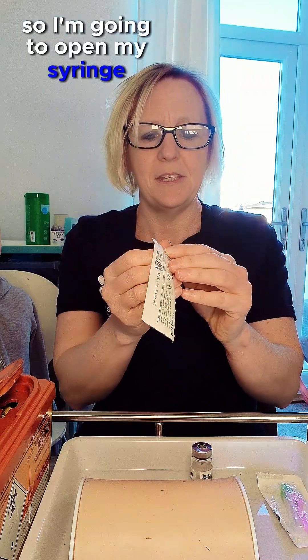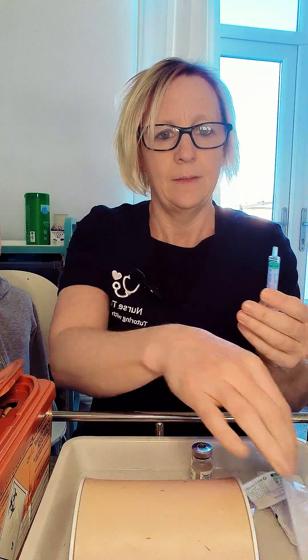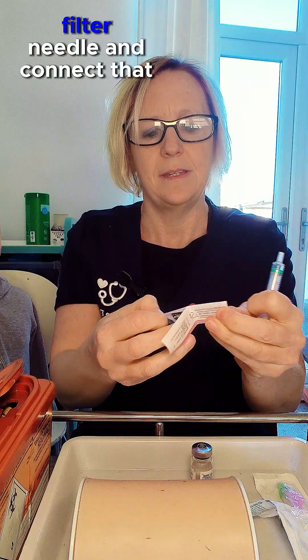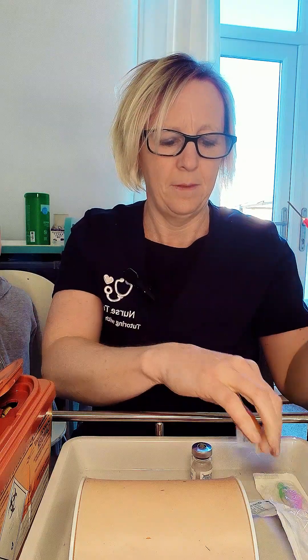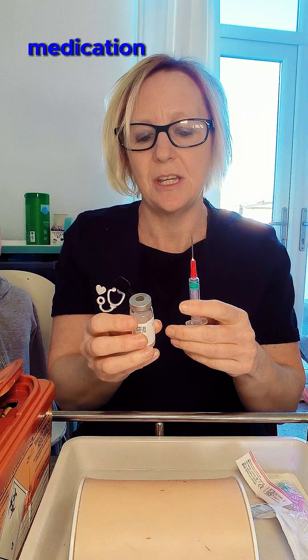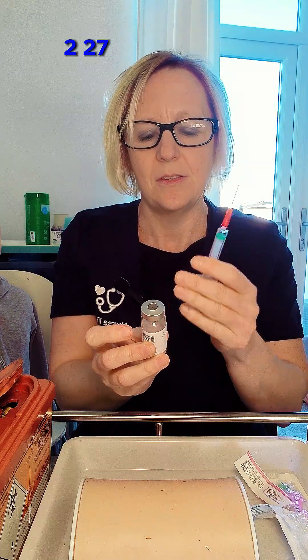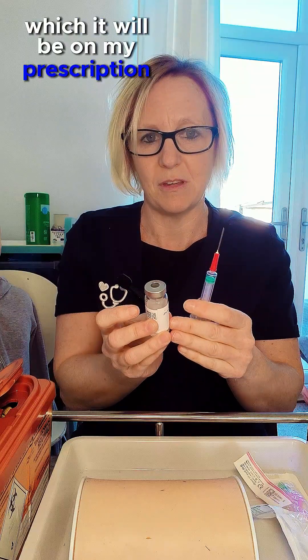I'm going to open my syringe — this is my key part, I don't want to contaminate that. I'm going to open up my filter needle and connect that onto my syringe. I'm going to get my medication which I've already checked and confirmed as the correct medication, the dose, and the expiry date. I've got hydroxocobalamin, five milligrams in five mils, expires 02/27. I'm going to draw up one milligram which is one mil, as per my prescription.